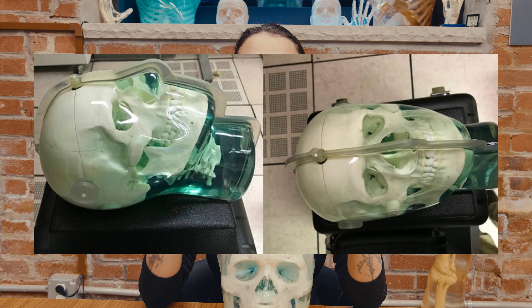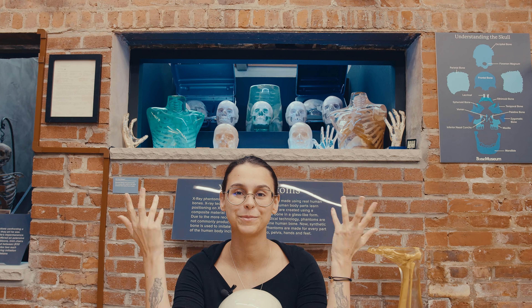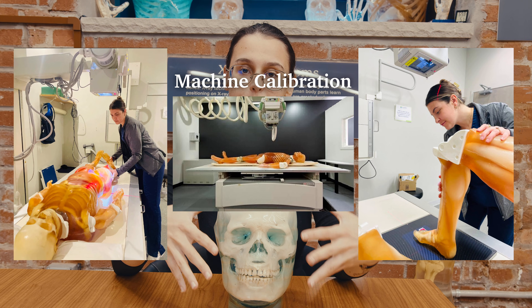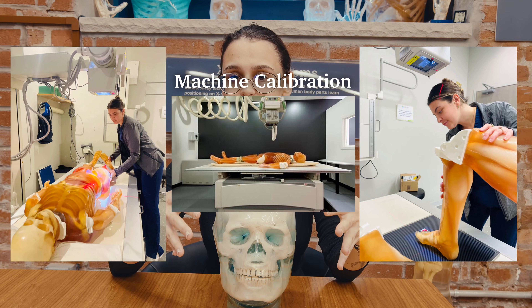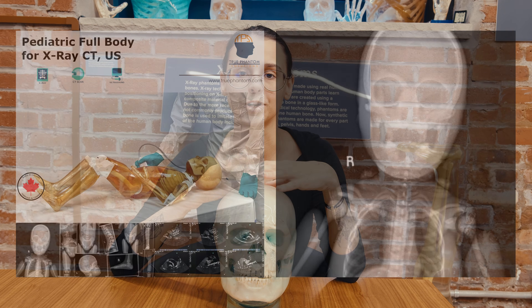X-ray phantoms were, and still are, very widely used in X-ray imaging. They're also the type of phantoms we have here at the museum. First of all, they're used for machine calibration. They provide a static object that could be placed into the X-ray machine, and by taking a photo of it, they can ensure that the machine is working properly.